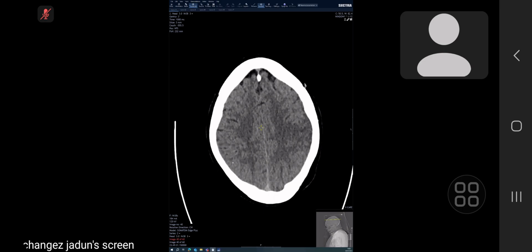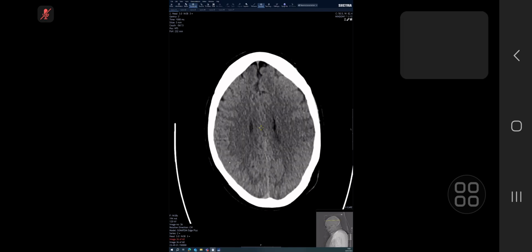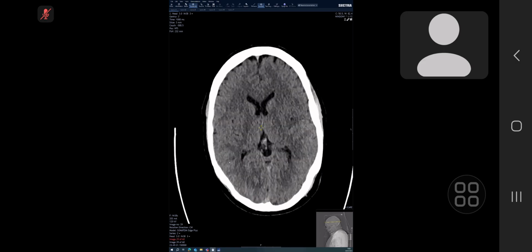But at this point, please stop here. I can see on the left frontal region an ill-defined hypodensity, which is confluent with the centrum semiovale. This hypodensity is ill-defined and seems to be irregular to me. Can we scroll downwards, please? Yeah, it's extending downwards, and it appears ill-defined.